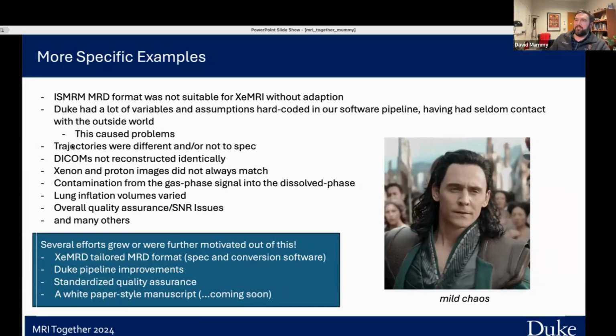No matter how you specify it, trajectories come out just a little differently. People have different ways of reconstructing DICOMs. All of the things I kind of alluded to at that very beginning slide happened, and then some. So we did learn a lot from this, and I'm going to talk about those efforts coming up here.